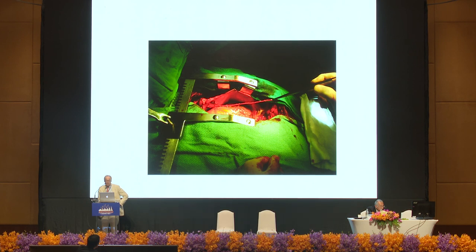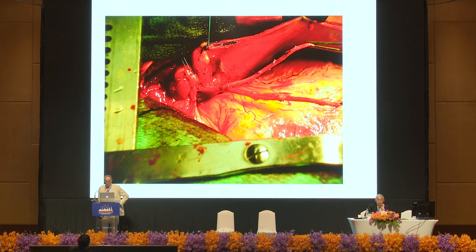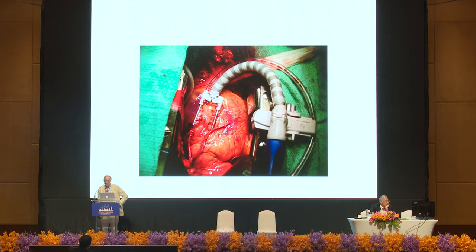You can understand its versatility. For example, if you look at that, easily cut the terminal section off, join it in as a Y higher up, and you can immediately graft two of your anterior wall vessels. So just a few replications, that's a case in point. You can do them off pump, obviously.